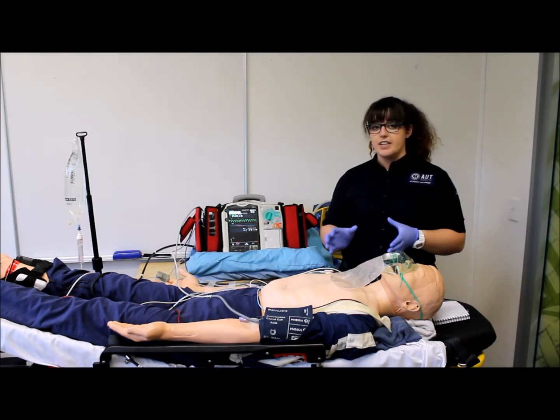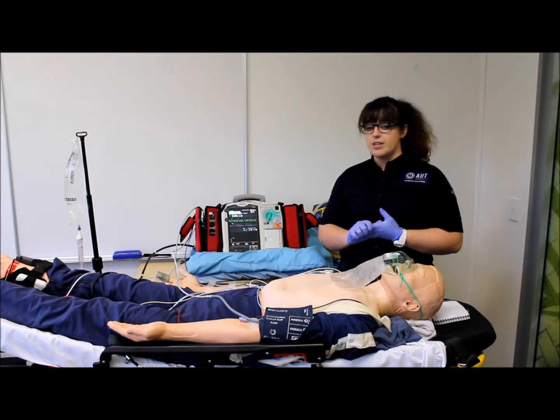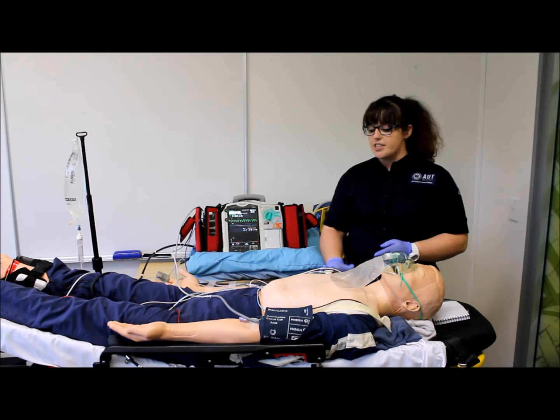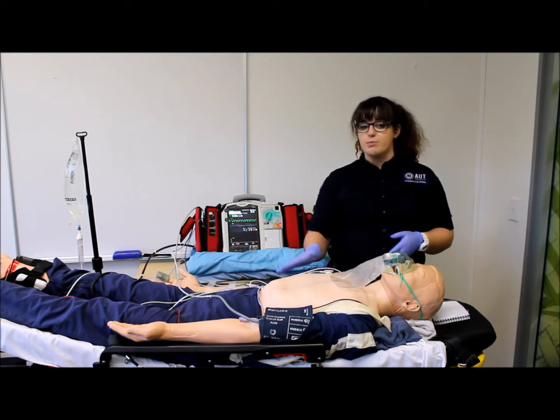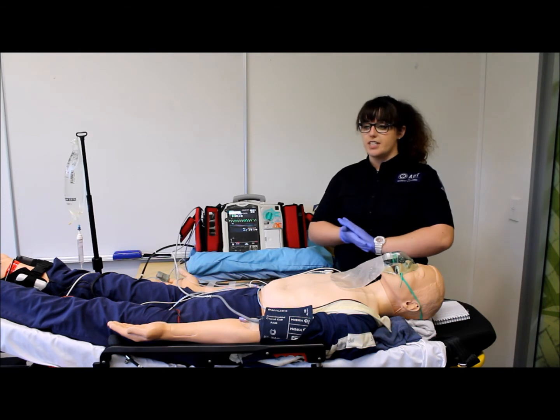Currently our patient is severely compromised, he is hypotensive, unable to obey commands, and is at high risk of going into cardiac arrest, and he looks status 1, he's pale, cool and clammy. We have currently got the pads attached to the apex and sternum. We have bilateral large bore IVs and fluids running to try and raise the blood pressure.